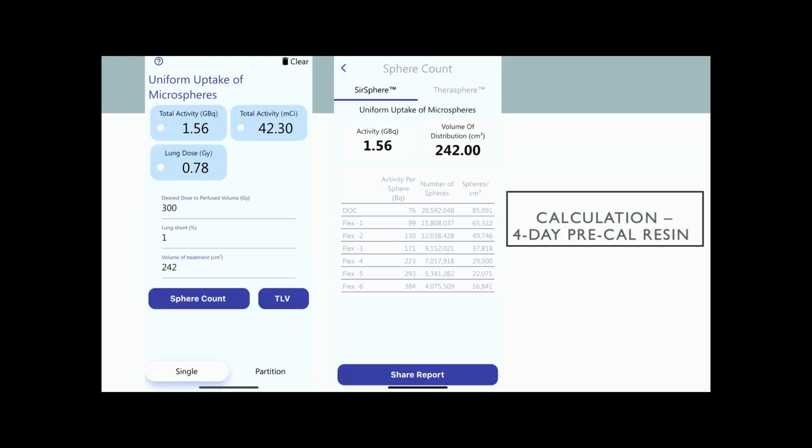So in a situation like this size tumor, what would you use for your dose to the segment? I'll probably be shooting somewhere around 600 gray to the perfused territory. I think the floor based on legacy data is for anything greater than 400. I think we're going to find new information.